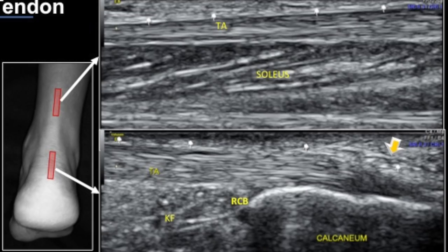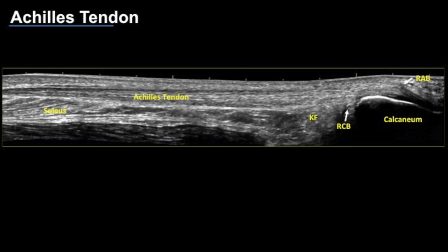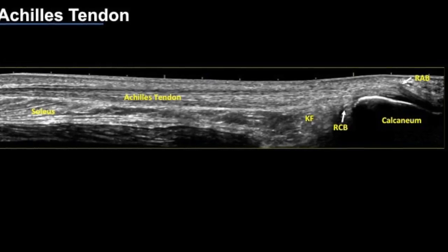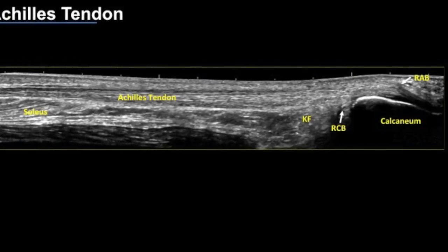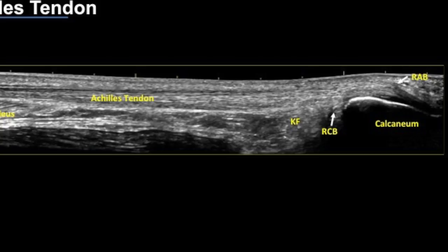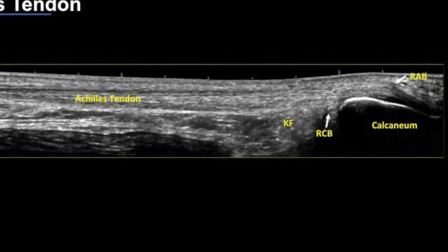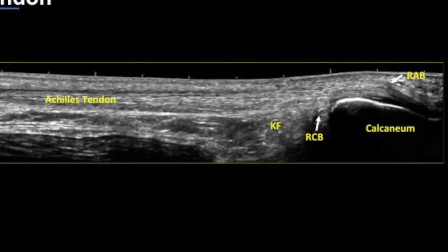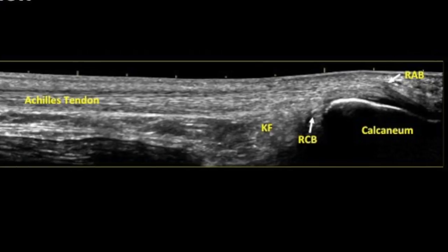We assess the Achilles tendon proximally at the myotendinous junction of the soleus, because most athletic injuries are going to happen at this site. Since the Achilles tendon is a broad area to scan, I would encourage those doing regular musculoskeletal ultrasound to start using panoramic or extended field-of-view sections, as the more anatomy you capture in one view, the better pathology is appreciated and everyone gets a better perspective.